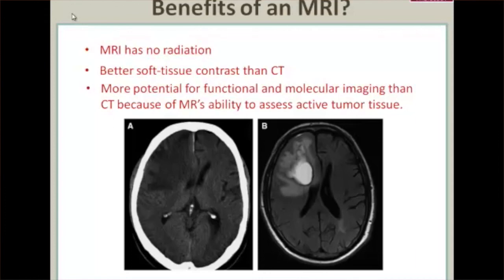So this image is actually an image of someone's brain, sliced this way on a CT. And if I use the helpful pointer, you can see that maybe something is not right here. If you look at the MRI, you can certainly see where the lesion is, and you can see that there's swelling and all sorts of upset brain around it. This is not an NET patient. But the example that I use is to understand how much more information MRI can give you.